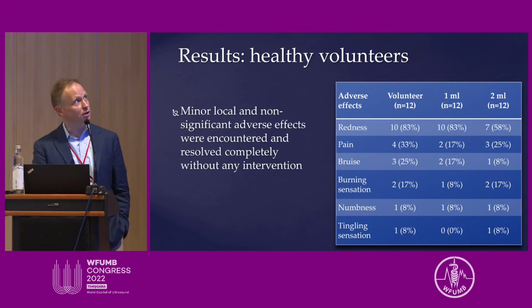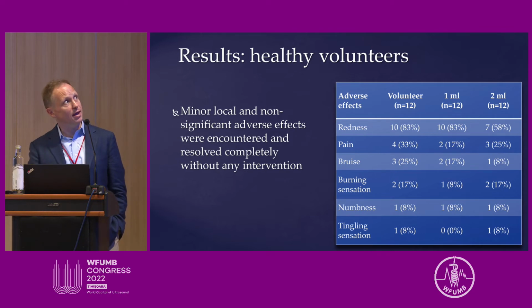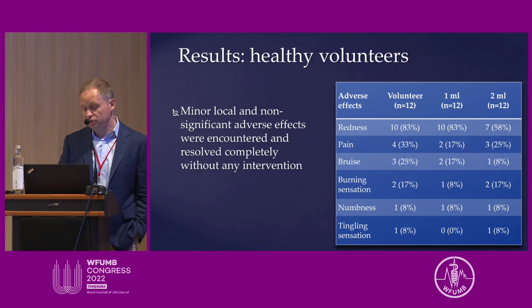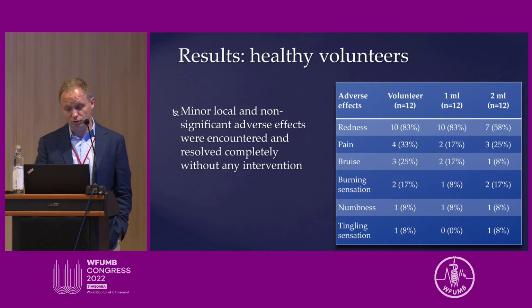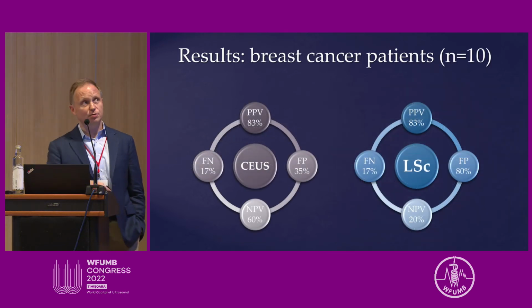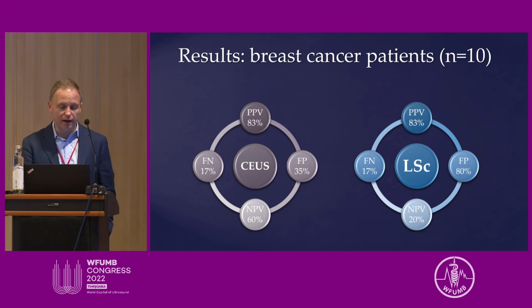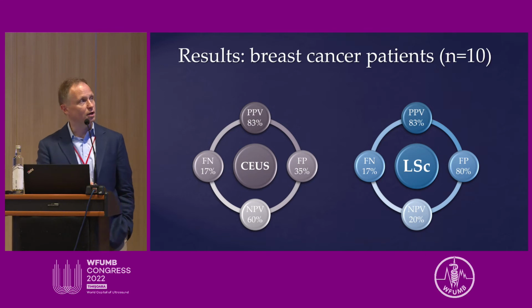It is not a very pleasant procedure, so to speak. Some patients would have redness. Some patients would develop a little bit of pain and then some bruising. But those are minor and pretty much similar to injection of radioactive dye. There was no significant difference. We also had 10 cancer patients in this study, and this was done with dye injection, with radioactive material injection, and with microbubbles.